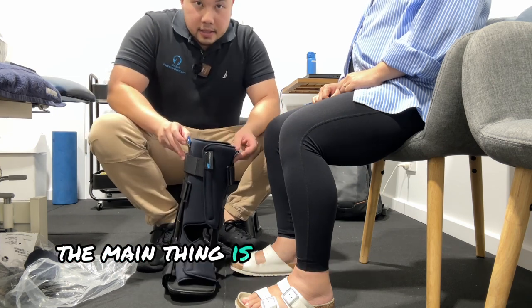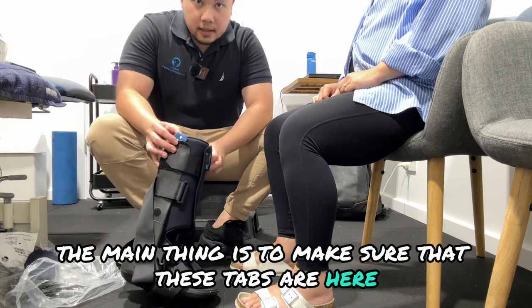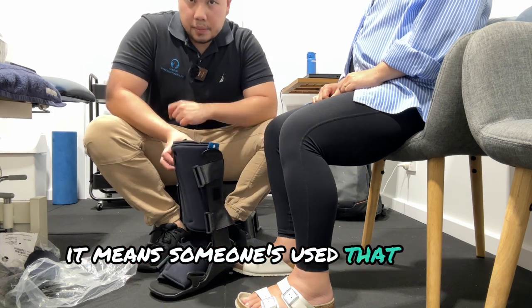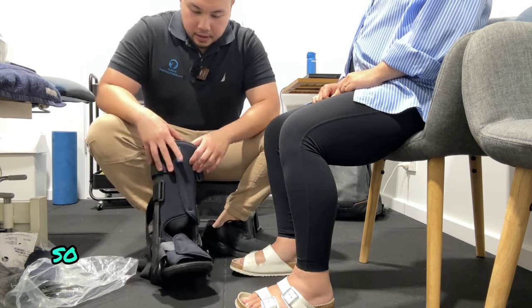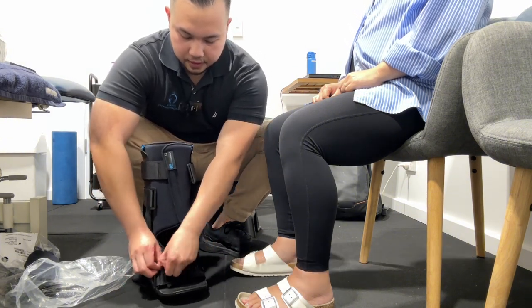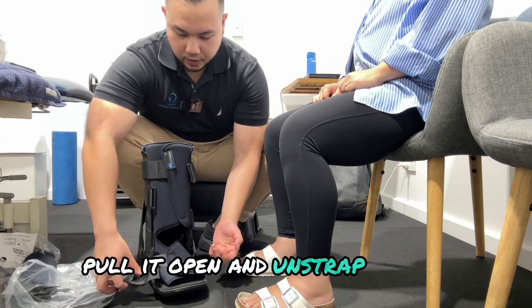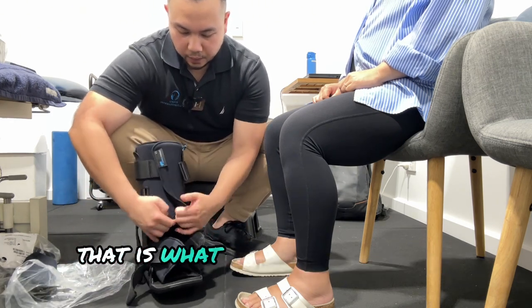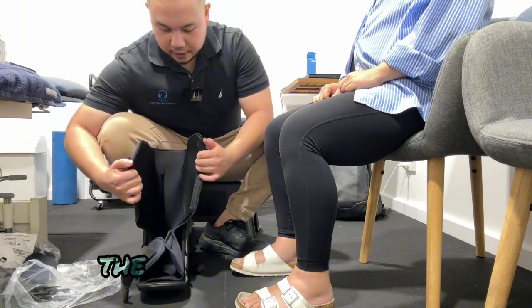When it comes in, the main thing is to make sure that these tabs are here, because if these tabs are taken off, it means someone's used that boot before. The majority of the time it's just covered in velcro, so you just need to pull it open and unstrap it. There's a lining underneath that is what we're going to use to actually fit the boot on the person.